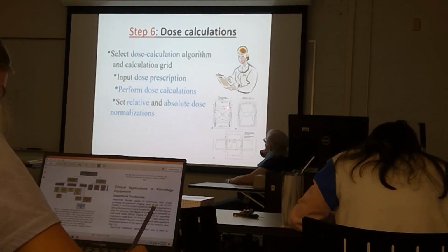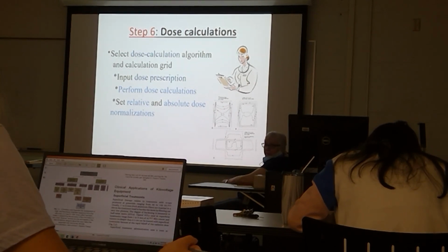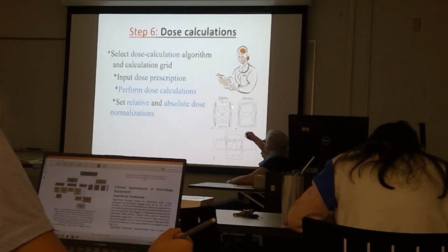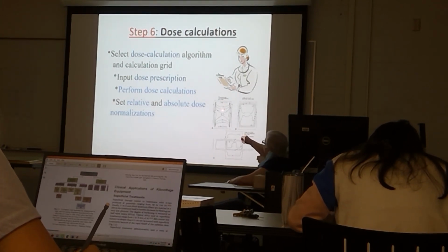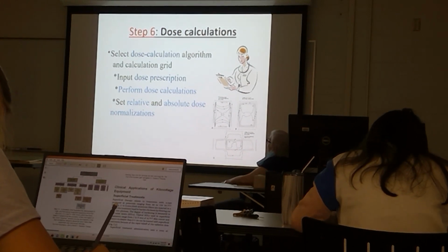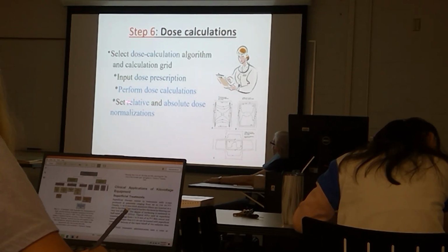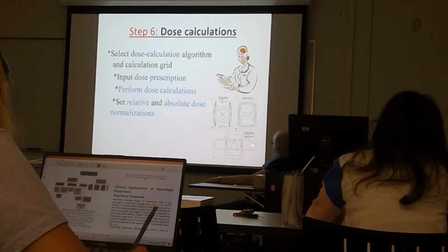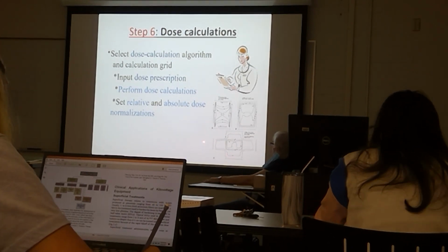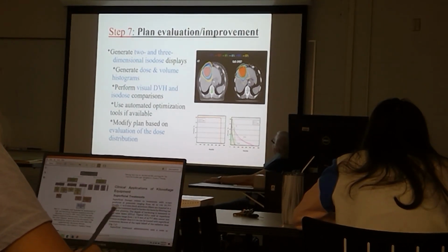And this might be 60%. So everything along this line is 60%. And they start off at 100 at D max, and then work their way down. So we set those calculations, we perform the dose calculations, and we finally get a dose here. So you get 4 fields, it's a 4-field box. 1 field here, 1 field here, 1 field here, 1 field here.